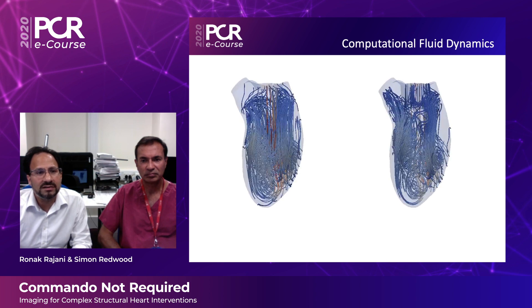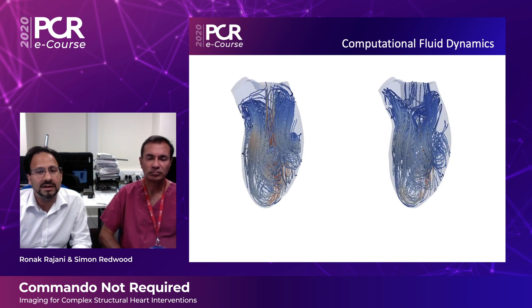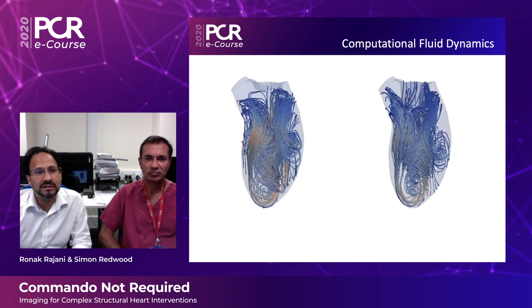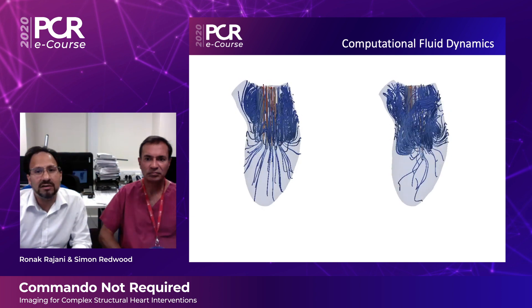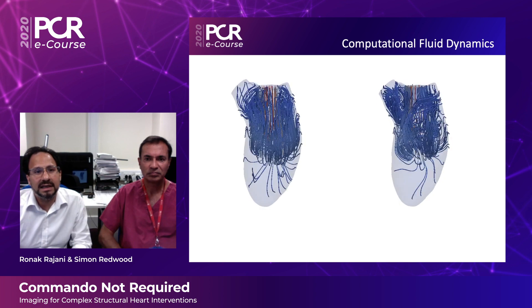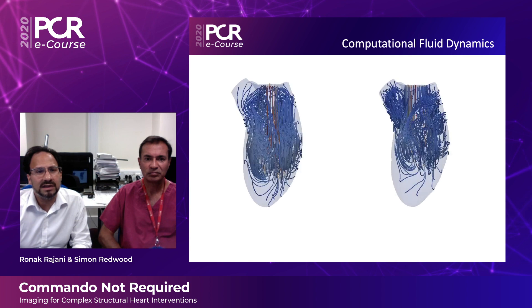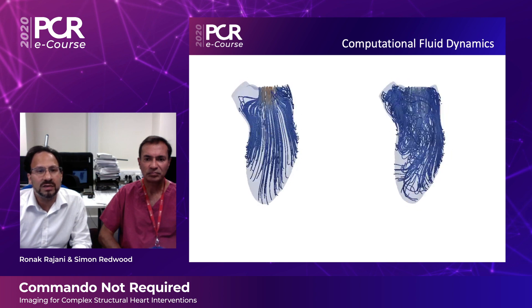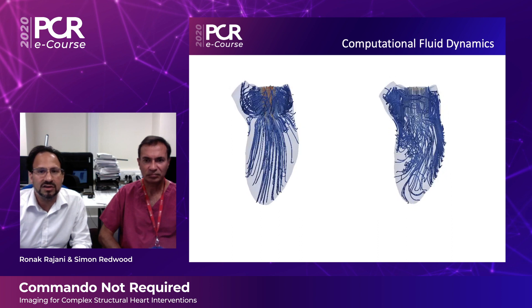On the right of your screen we've virtually implanted the 29mm Sapien III valve onto this mesh, from which we can derive the pressure, flow, and velocity within the neo-left ventricular outflow tract once the valve is deployed. In this particular case we were able to demonstrate that there was unlikely to be any significant LVOT obstruction with a 29mm Sapien III valve in the mitral annular calcification position.